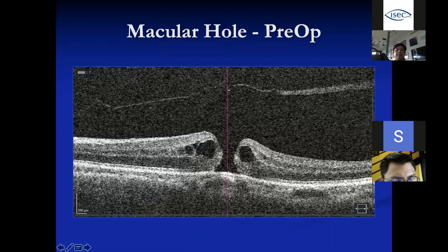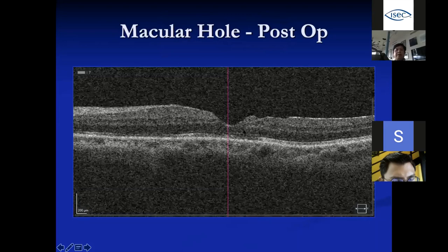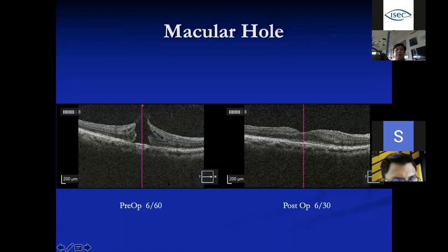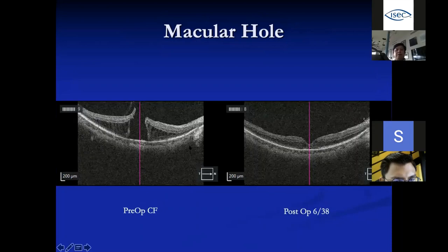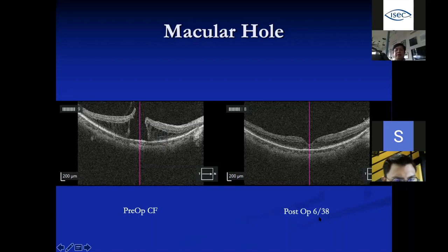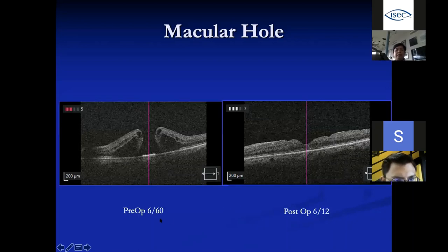Another pre-op case: the larger the hole, the harder for the edges to meet. After surgery, the edges join back. Another example: pre-op vision 6/60, post-op 6/30 — not 100% but three lines of improvement on the chart, which the patient appreciates. Another patient, counting fingers pre-op with the retina drawn apart and nerve fiber layer split, vision improved to 6/38 after operation. Another full-thickness hole: 6/60 pre-op, joined together post-op, achieving 6/12.